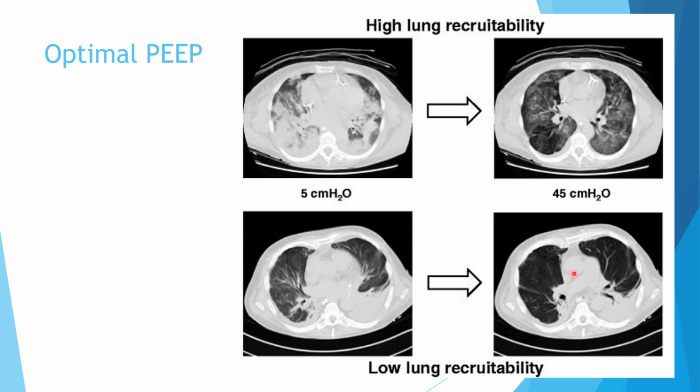Remember, gas is going to follow the path of least resistance. So all of the gas went to here, so now this patient's going to have some VQ mismatch because these alveoli are overinflated. These ones are not inflated at all, so you're having a big VQ mismatch. For this one, it's pretty good because these alveoli are now participating when previously they weren't. So there gets to PEEP, so that would be optimal PEEP.